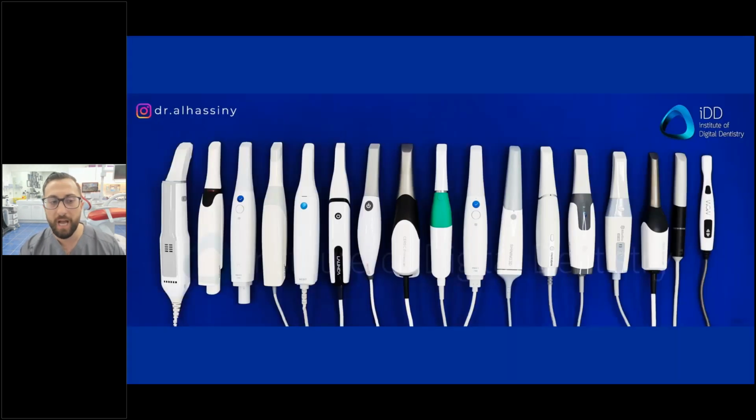So from those humble beginnings with those two scanners, these days we basically use every single scanner in my practice, and I've used every scanner. This picture was taken last year in the practice, and it's not even an exhaustive list because there are some missing there, such as the i600, such as the Dexis 3800 wireless. And the reality is that every single scanner has its own pros and cons.